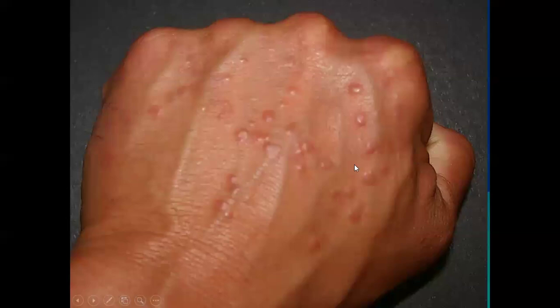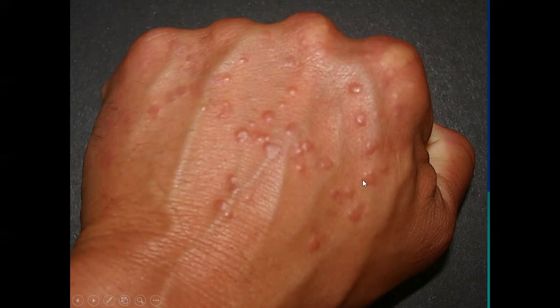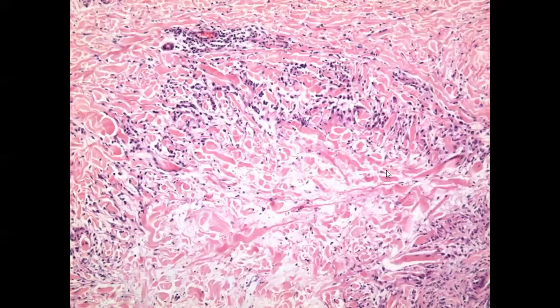So here you can see lots of small papules and nodules, mainly on the dorsal surface, and sometimes we see these in an annular fashion as well. These infiltrated papules are granuloma annulare. You can see the necrobiasis. Necrobiasis is distorted collagen, but not totally acellular like caseation. And we see granulomatous inflammation, although the granulomas surrounding these areas of necrobiasis are not well-formed. They are ill-formed granulomas, but they are mainly in the form of a palisade surrounding the areas of necrobiasis.